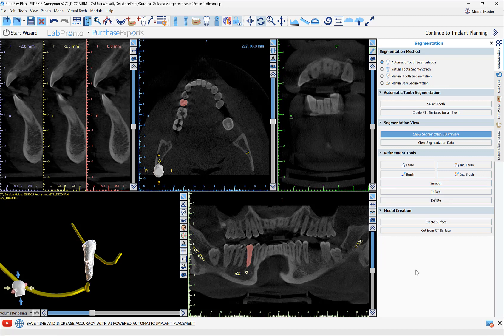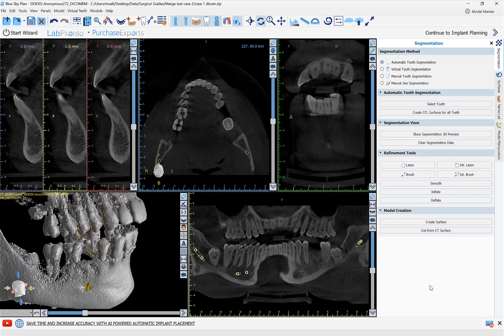We have different functionality here for smooth, inflate, and deflate — that's more relevant if you're going to be creating an STL file of the tooth. But if you just want to remove it from the CT scan, simply click 'Cut from CT Surface.'